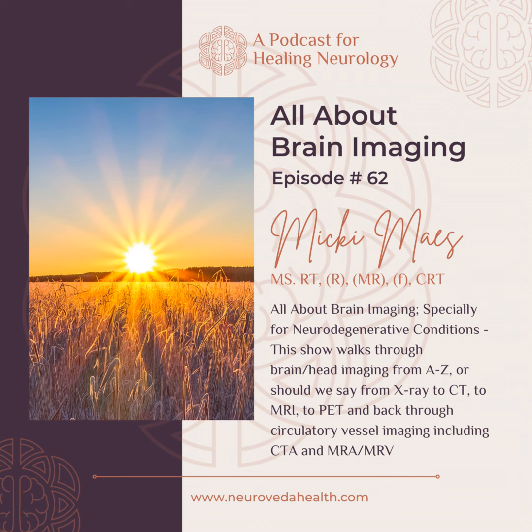Right. So CTA, or computed tomography angiogram, always is going to require contrast media. So there's a little bit of a risk to the patient in using CT in that it also uses ionizing radiation like X-ray, and you're going to have contrast media or iodine.